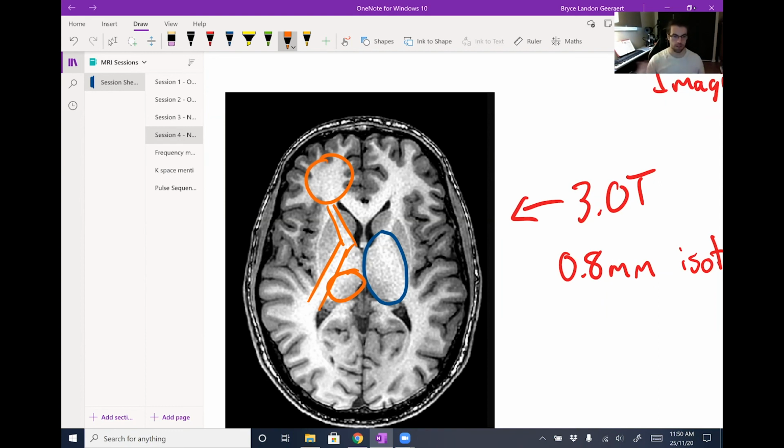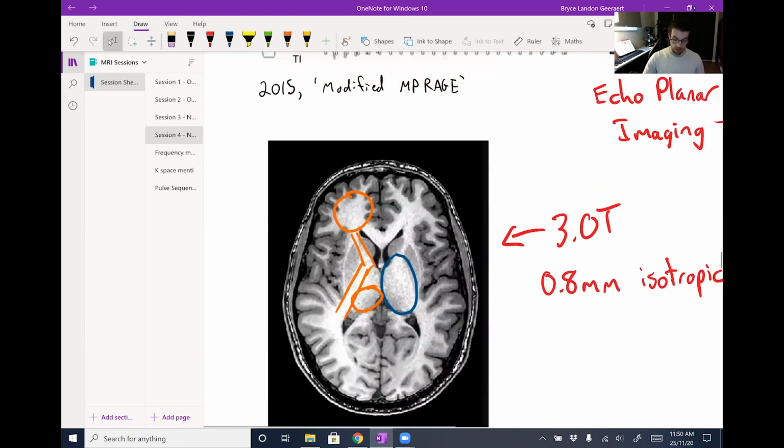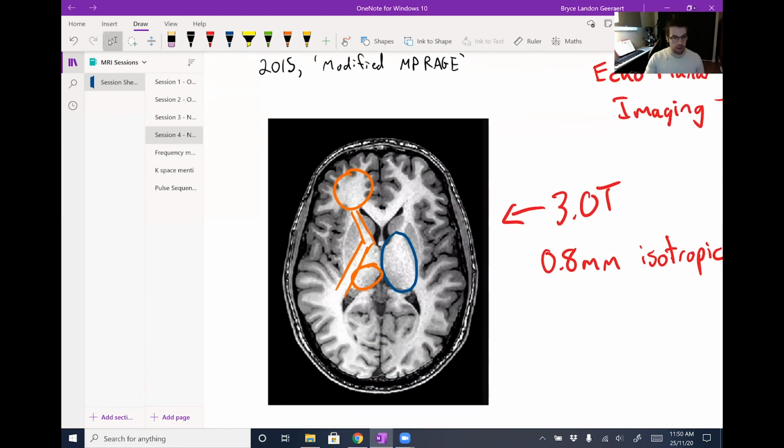So this is the SNR. It's the constant battle to maintain resolution and have enough signal to outweigh noise. And that is what informs the choice of scanning parameters in MRI. Thankfully for me and for probably many of you, we don't need to fiddle around with those parameters very much, as there are various skilled physicists that are designing these sequences. But of course, it's very important to understand what those parameters are actually doing for our images. Yeah, and that's everything that I've got before diffusion weighted MRI.